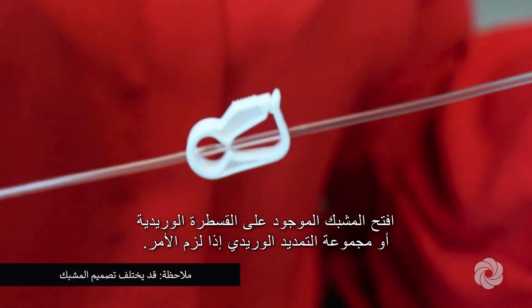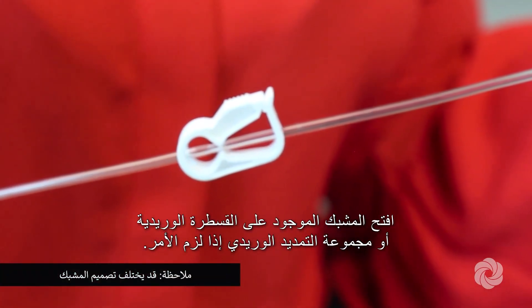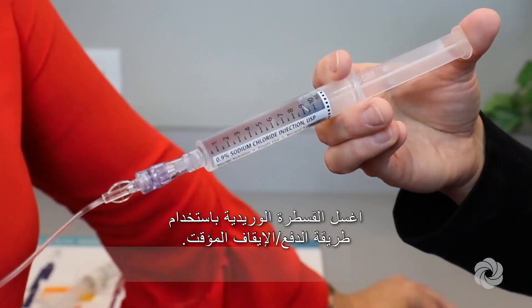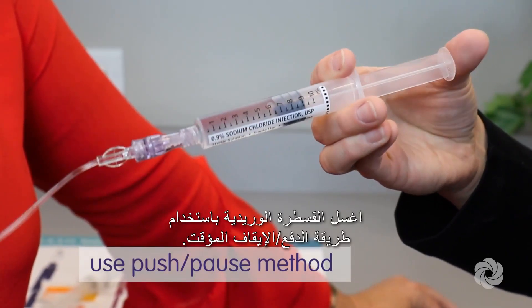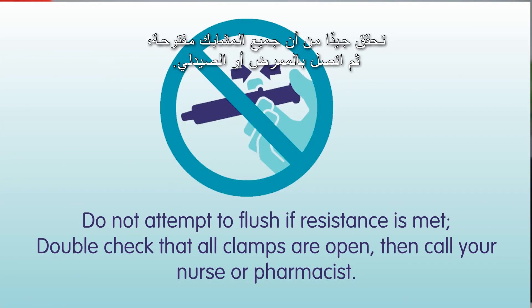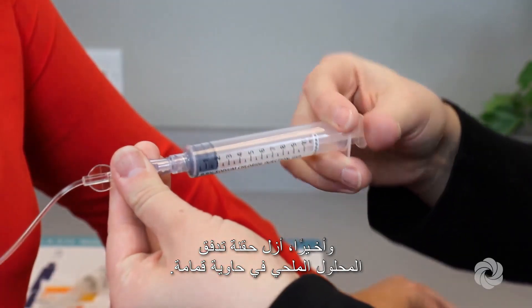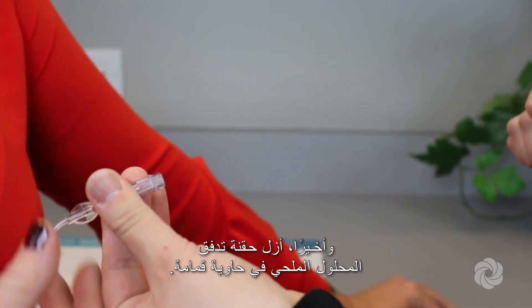Open the clamp on your IV catheter and/or IV extension set if indicated. Flush your IV catheter using a push-pause method. Do not attempt to flush if resistance is met — double check that all clamps are open, then call your nurse or pharmacist. Lastly, remove and discard the saline flush syringe in a trash container.